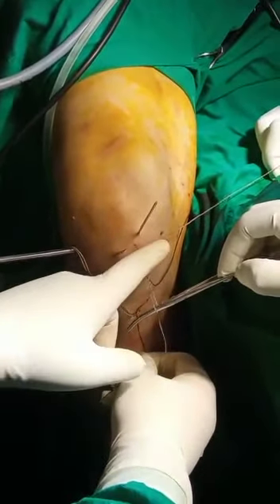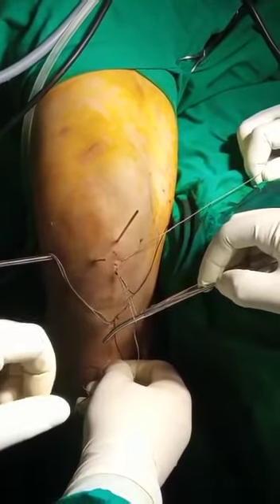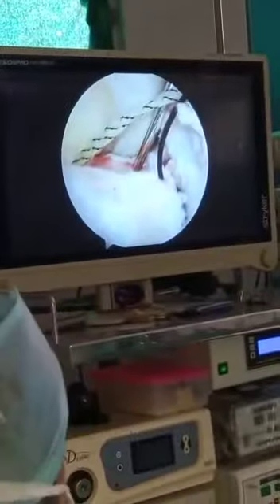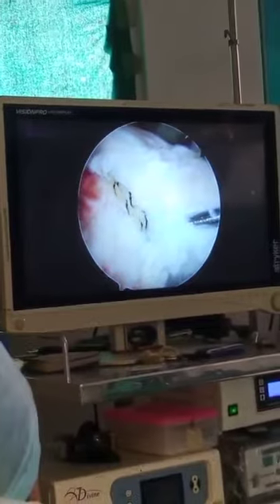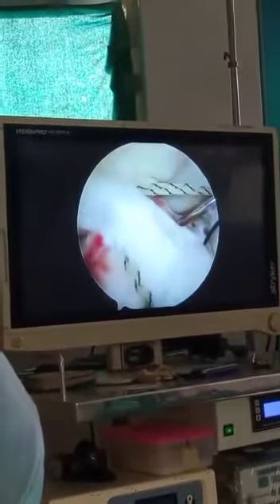From the middle tunnel — there are two — our plan is to make three tunnels because the fracture is comminuted and the fragment is large enough. This thread is coming from the lateral tunnel and going intersubstance.